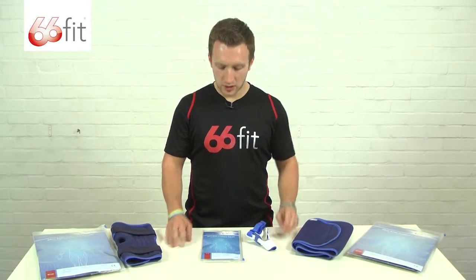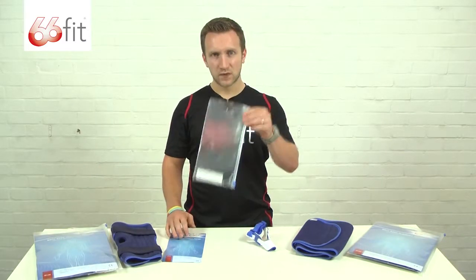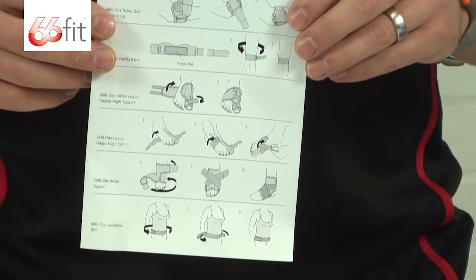This is a selection of the 66 Fit Elite range of supports. They all come packaged in a durable ziplock bag, and inside you get your support as well as an instruction card. On the front you've got an anatomical drawing and on the back you've got various fitting instructions for whichever support you've purchased.